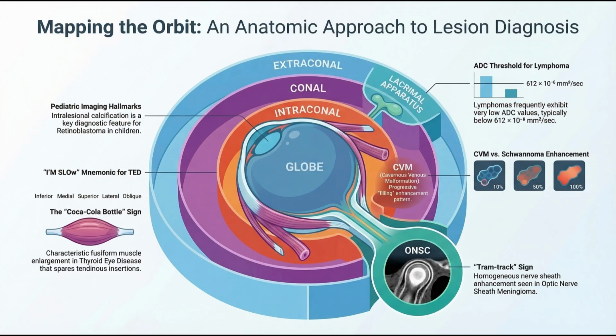That's it exactly. But the choroid, the layer right beneath the retina, which holds all the blood vessels, isn't anchored in the same rigid way. When the choroid layer detaches due to fluid buildup, it just bulges heavily inward from the sides. So no V shape. No. Instead of a tight V shape, a choroidal detachment bulges out and looks thick and curved. The source describes it beautifully. It looks like a biconvex round tennis ball sitting inside the eye. A V shape versus a tennis ball. It's almost like the body is leaving giant visual clues if you just know what you're looking at.